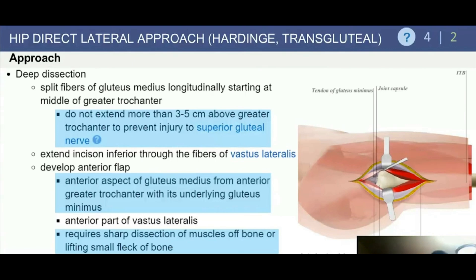Do not extend the dissection proximally above the trochanter, to prevent injury to the superior gluteal nerve. Inferiorly, take the dissection down into the vastus lateralis and develop the anterior flap. This can be either a soft tissue flap — taking the gluteus medius off its anterior insertion into the tip of the trochanter — done sharply, or alternatively with a small fleck of bone for later reattachment.